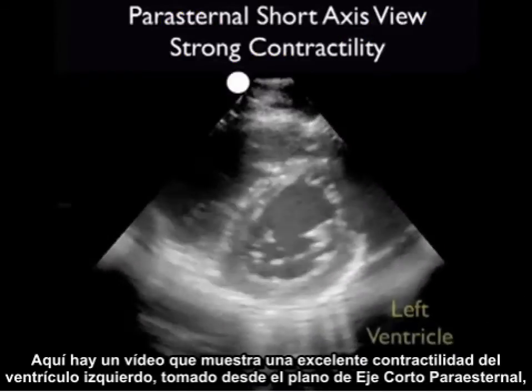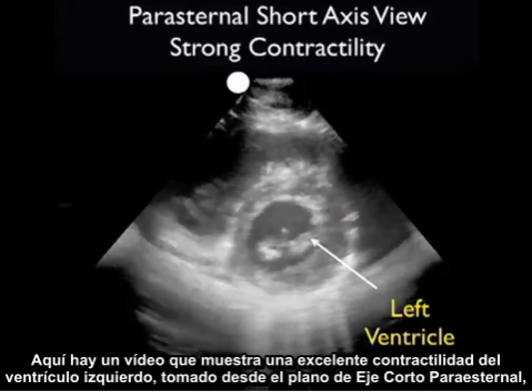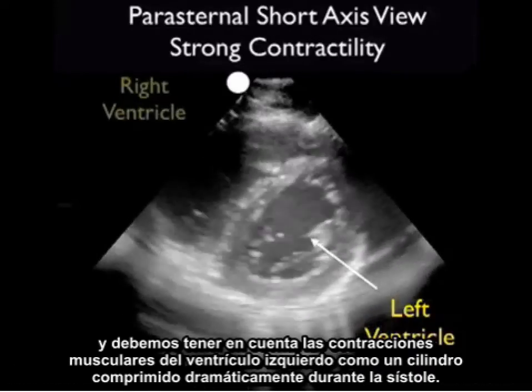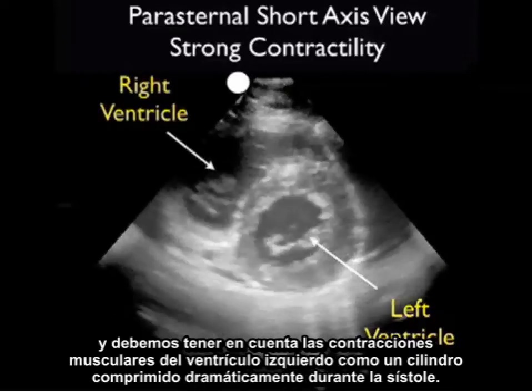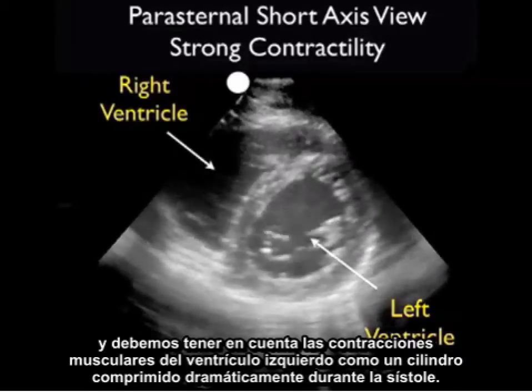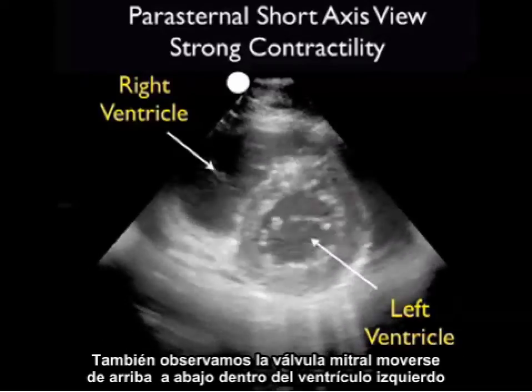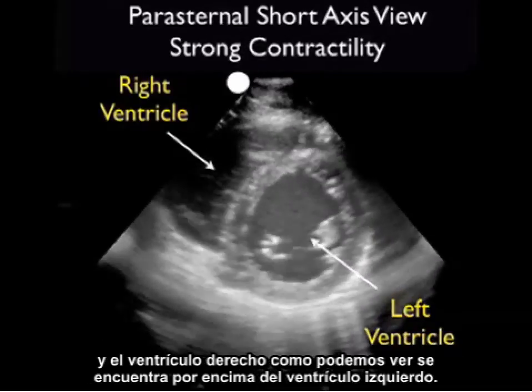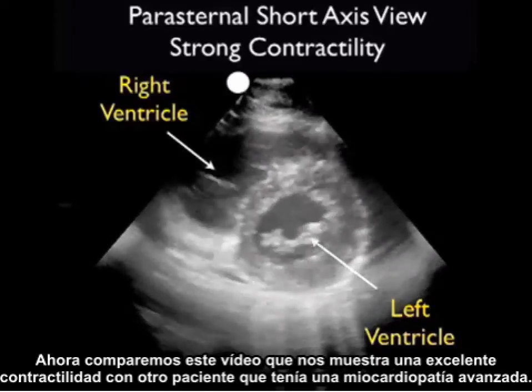Here's a video clip showing excellent contractility of the left ventricle as taken from the parasternal short axis plane. Note the muscular contractions of the left ventricle as a cylinder squeezing in dramatically during systole. We also note the mitral valve flipping up and down within the left ventricle, and the right ventricle as seen up and above the left ventricle.